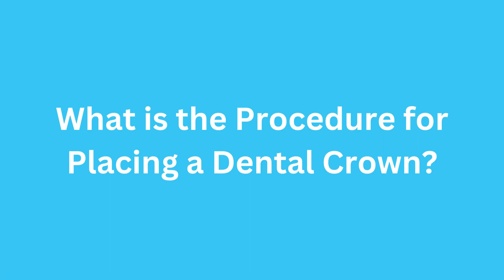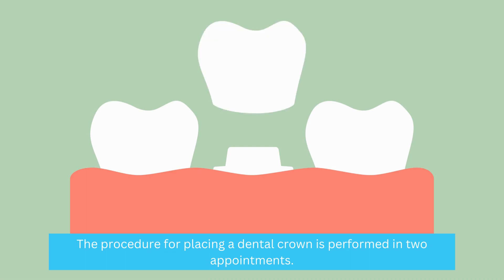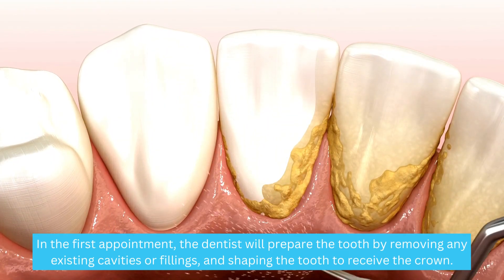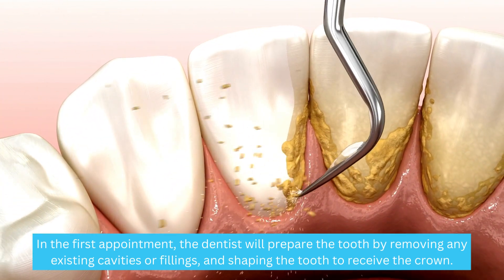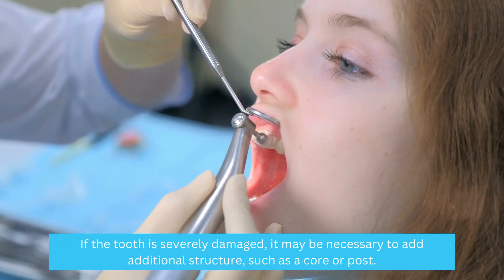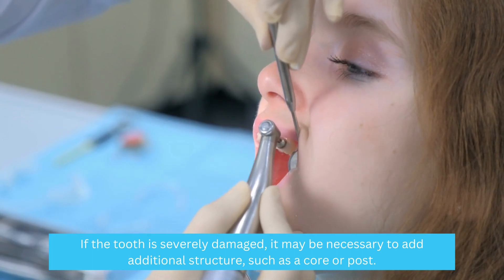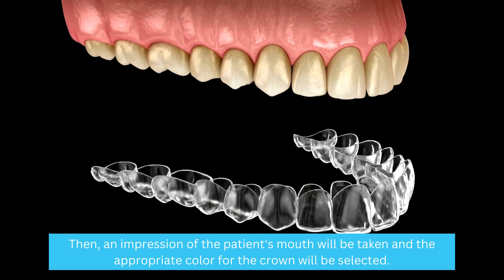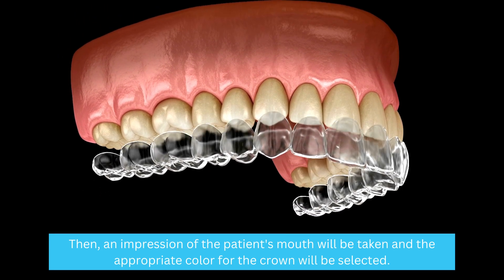What is the procedure for placing a dental crown? The procedure for placing a dental crown is performed in two appointments. In the first appointment, the dentist will prepare the tooth by removing any existing cavities or fillings and shaping the tooth to receive the crown. If the tooth is severely damaged, it may be necessary to add additional structure, such as a core or post. Then, an impression of the patient's mouth will be taken and the appropriate color for the crown will be selected.